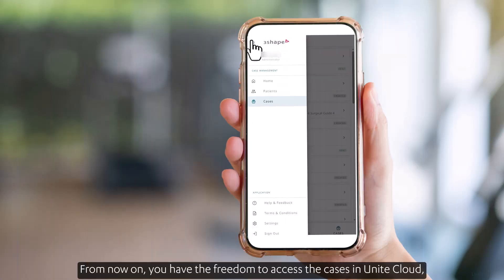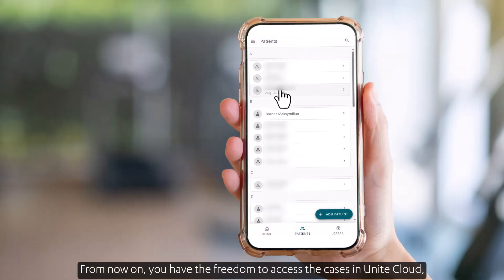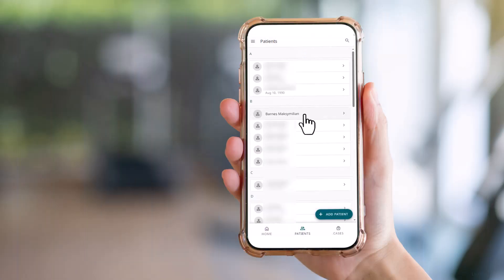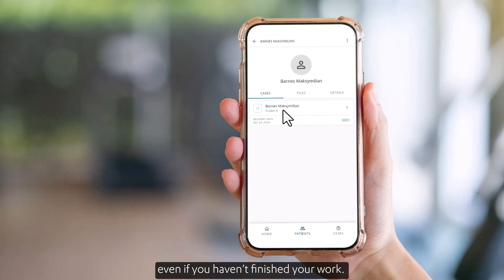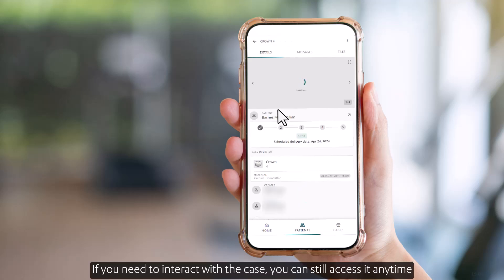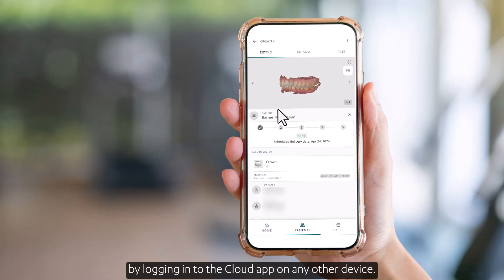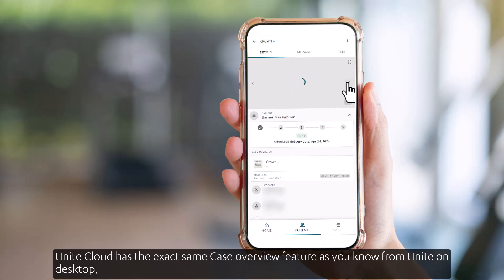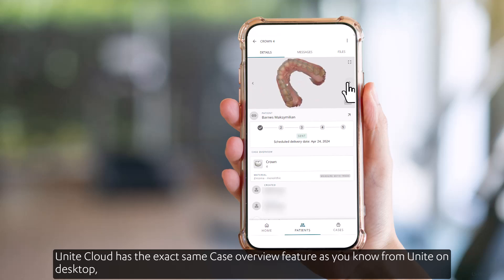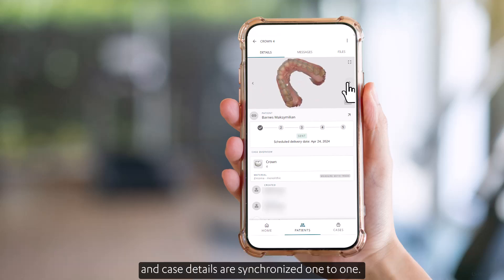From now on, you have the freedom to access the cases in Unite Cloud, even if you haven't finished your work. If you need to interact with the case, you can still access it anytime by logging in to the cloud app on any other device. Unite Cloud has the exact same case overview feature as you know from Unite on desktop, and case details are synchronized one-to-one.